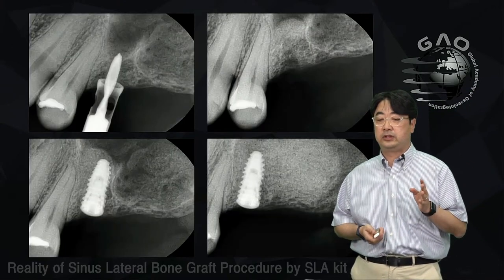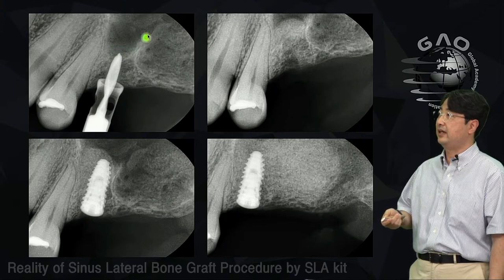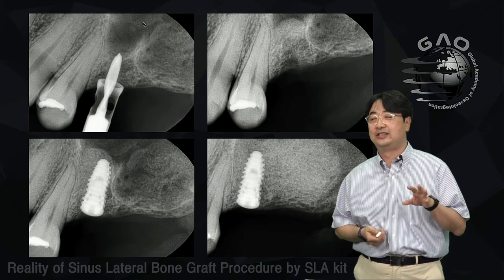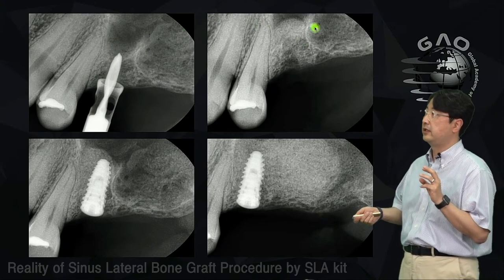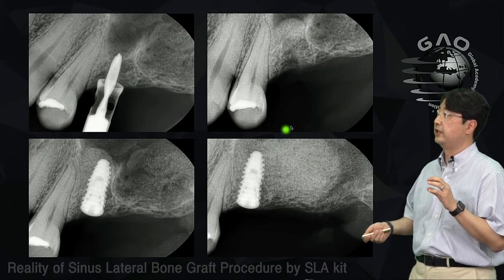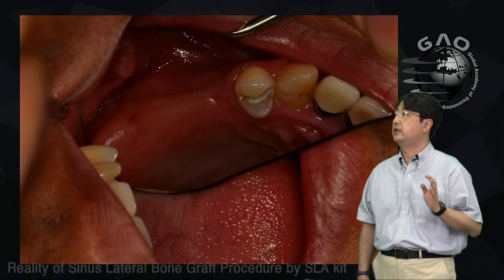Okay? So this is a radiograph showing I'm using the SCA and doing the bone graft from the crestal. And because of the septa, right? It's a very well-contained defect. So you can easily do the bone graft through the crestal for this area. But posteriorly, there is not much bone, so I decided to go for the lateral approach to fill the bone up to the septa, right?